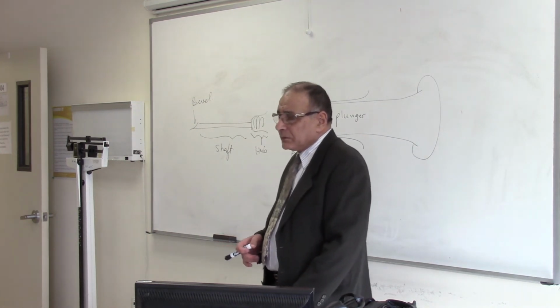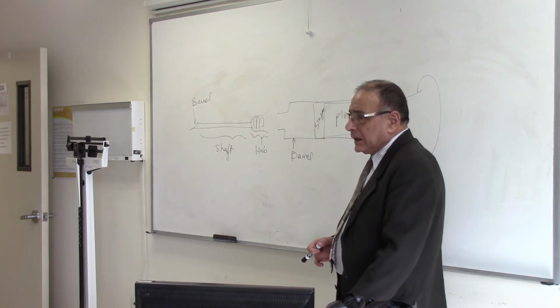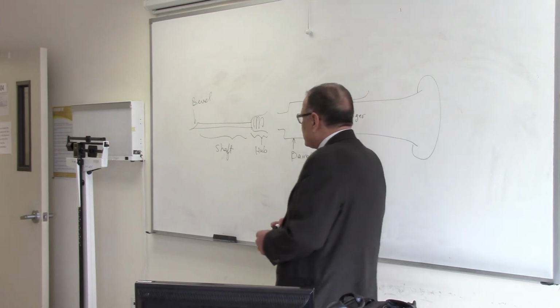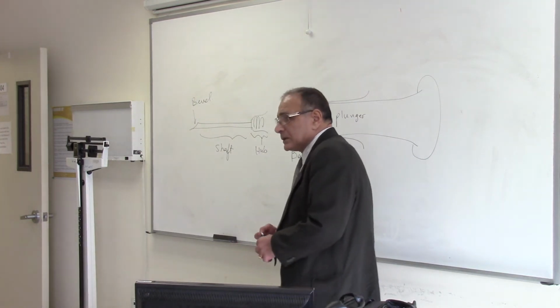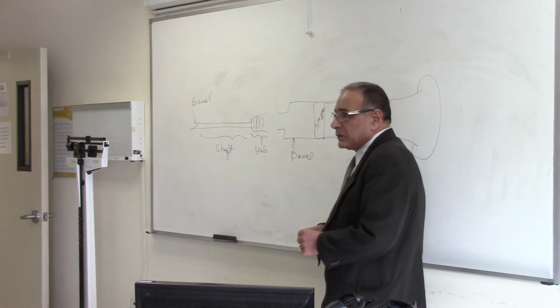That was before the vacutainer, or the vacuum system. The vacuum system is a closed system. Now we don't use the syringe anymore to draw blood.